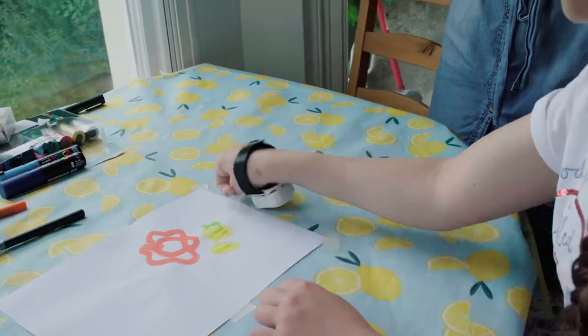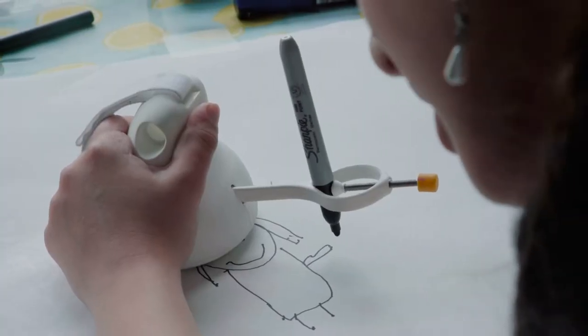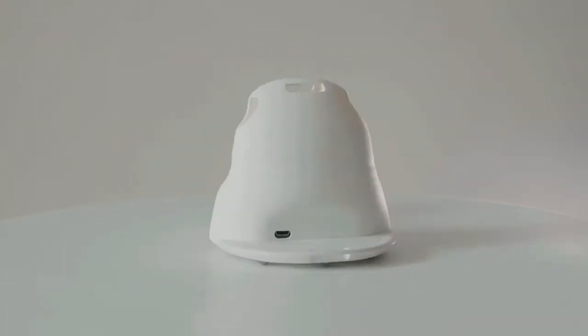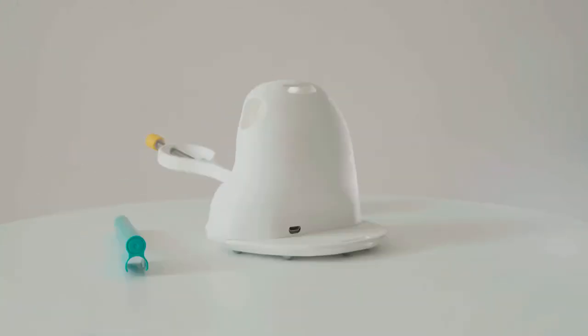People who are unable to do so themselves can use the remote control to raise the pen on and off the drawing surface. It's both a recreational tool for individuals to use in their homes and a professional tool for occupational therapists, art therapists, and artists.